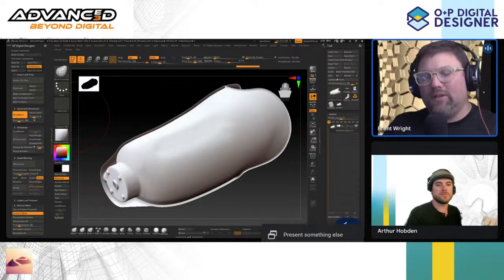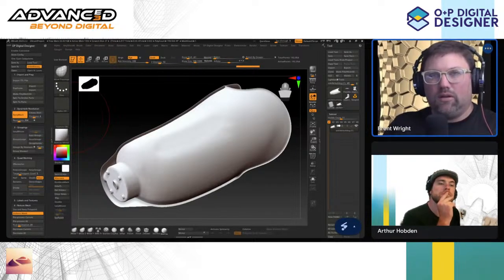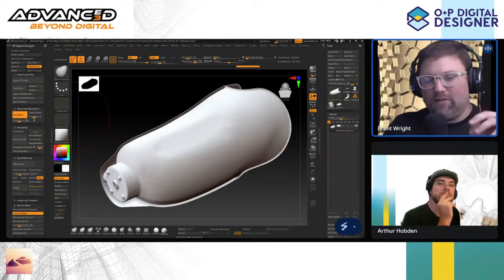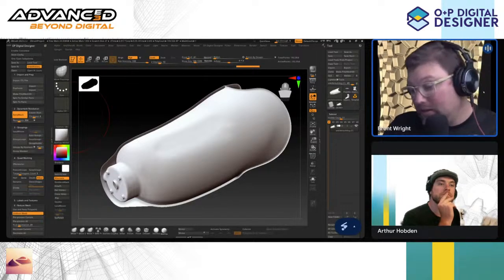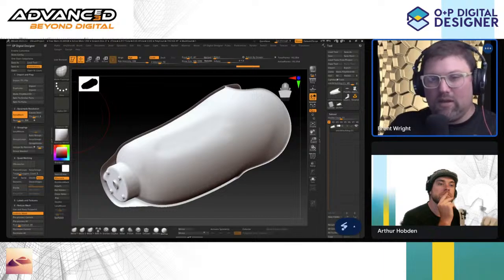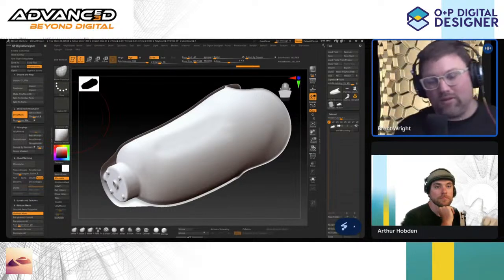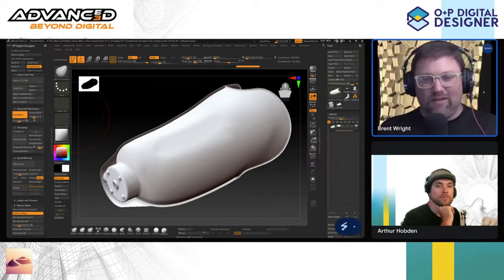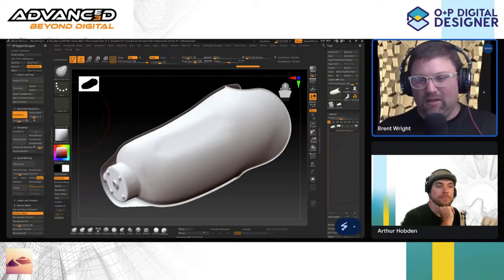So I believe one of the things that is super important for the O&P specific modification software is that they don't let you get to the spot where you can get a socket or a mesh out with trim lines. And I think that's a big mistake, because the O&P software can only do so many things, and there are clinicians that may want to do some other things. So just recently I had a clinician who could not get the mesh out, so they just modified a socket in a well-known O&P program, and they sent me the socket.